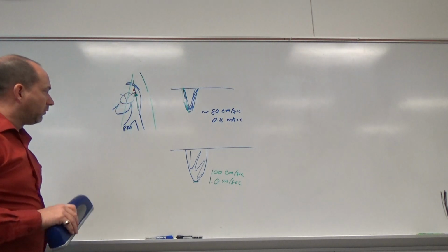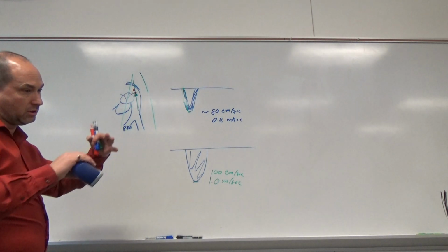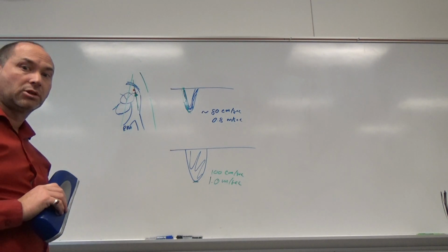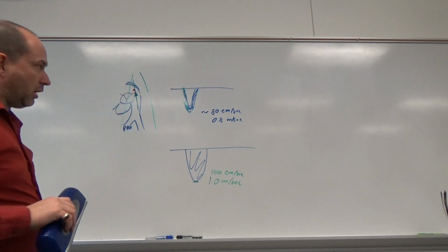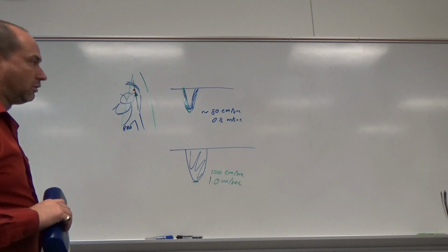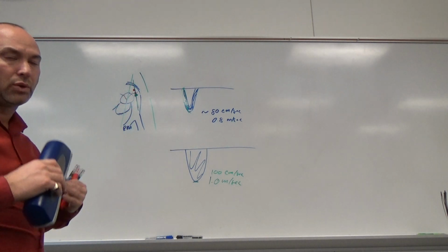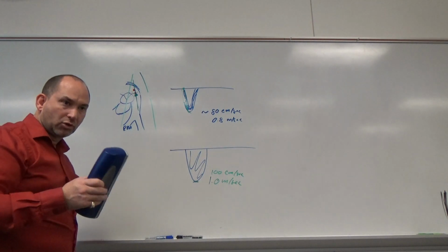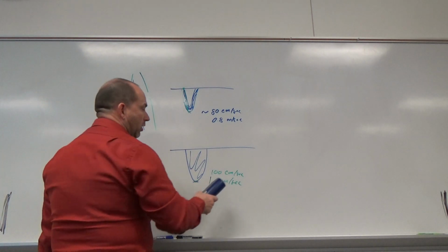So that's all we need for parasternal short axis. At the base, we take a clip of it. You can add a lot of depth to it, which will give perception of any kind of fluid collections outside the heart. And then focus in on it, only putting about 1 to 2 centimeters beyond the structure that you're interested in, so that you have a nicely magnified image without actually blowing up just the pixels with the zoom. We want that information to be as real as we can, and to save our frame rates.